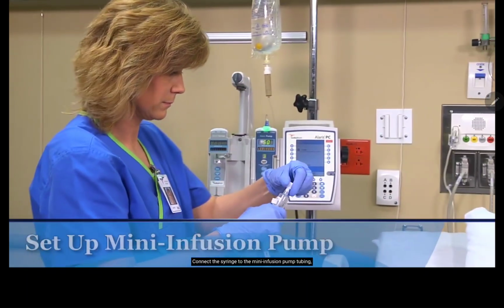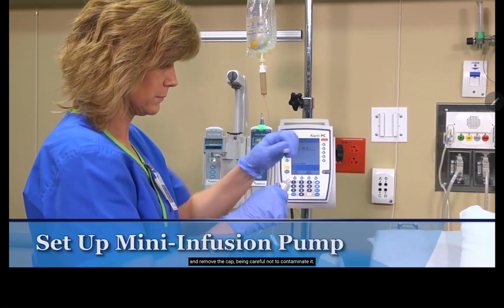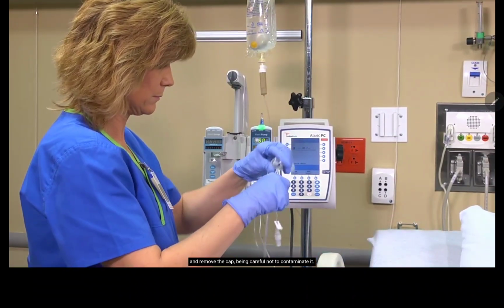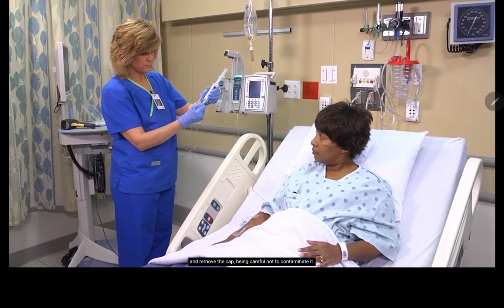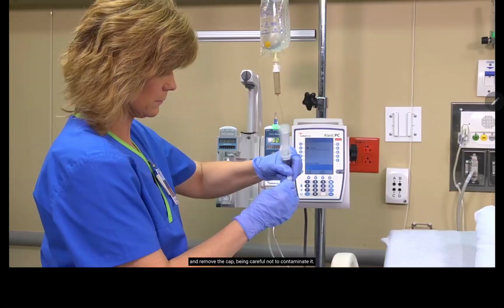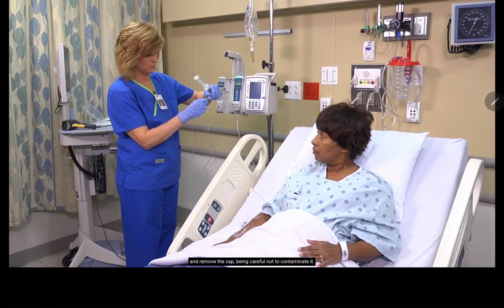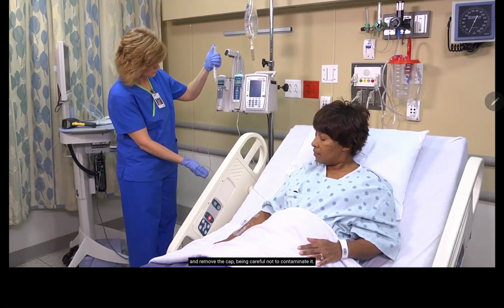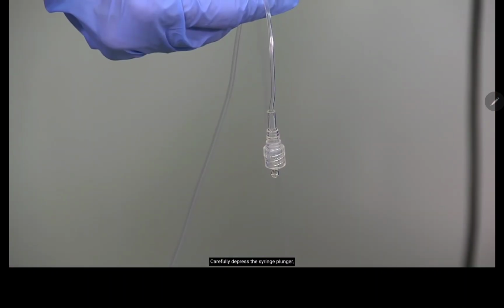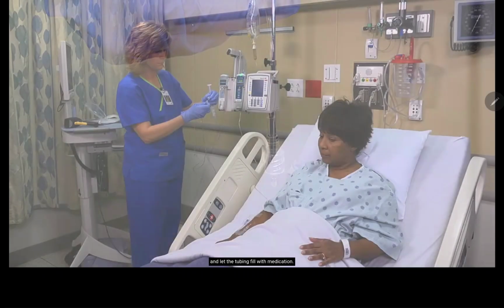Connect the syringe to the mini infusion pump tubing and remove the cap, being careful not to contaminate it. Carefully depress the syringe plunger and let the tubing fill with medication.